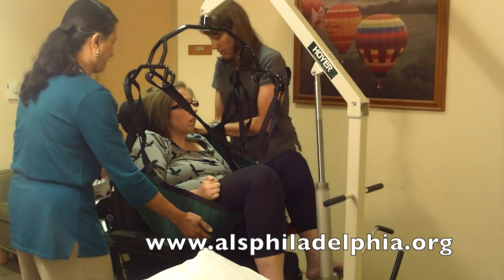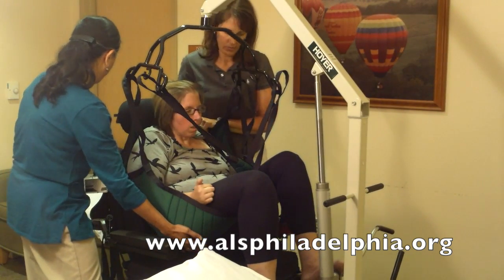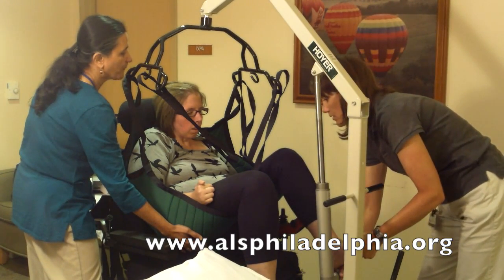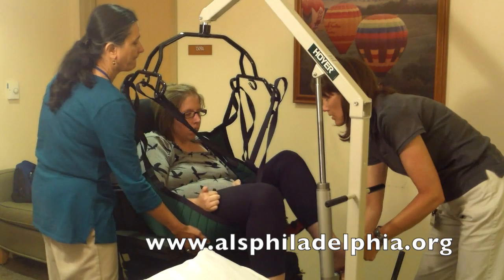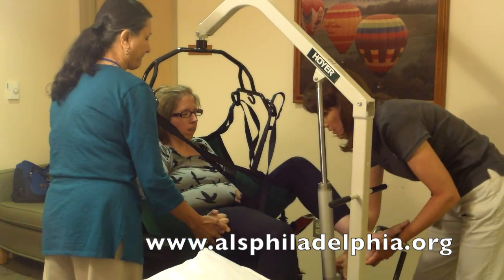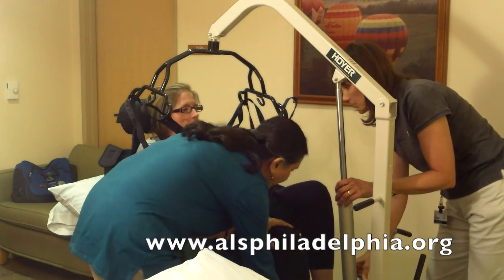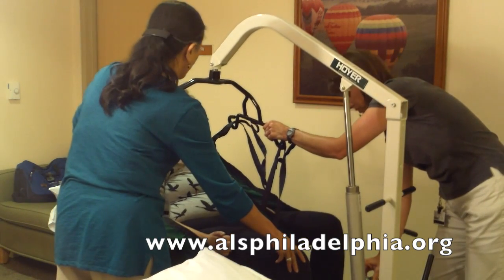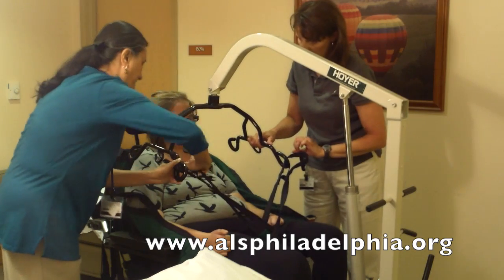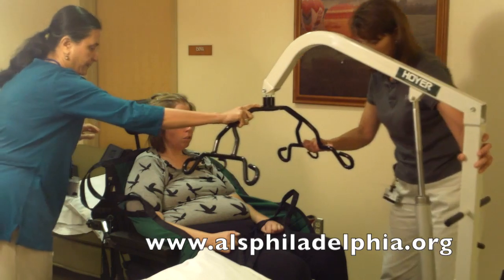Using the knob, slowly lower the patient into the wheelchair while positioning the back and legs as needed. This might be a process that needs to be done in stages so that the patient can be adequately positioned in the wheelchair. Put the footrest down so that the patient can be able to rest her feet.